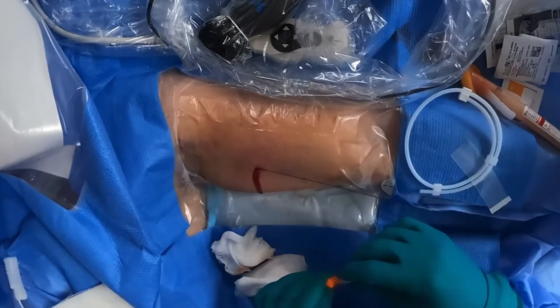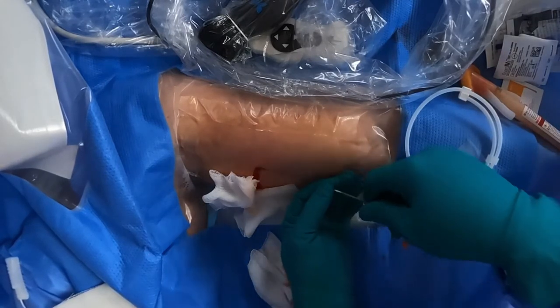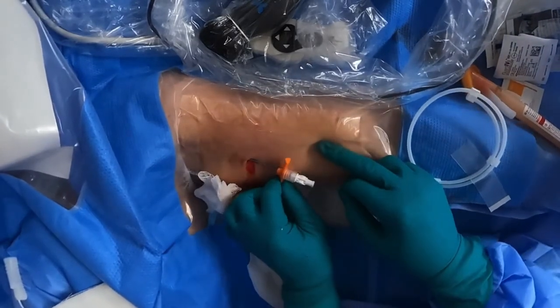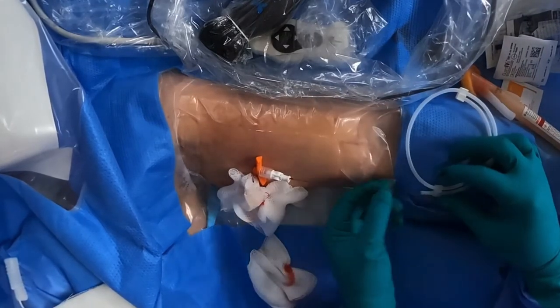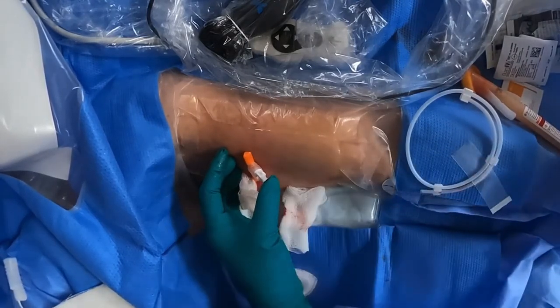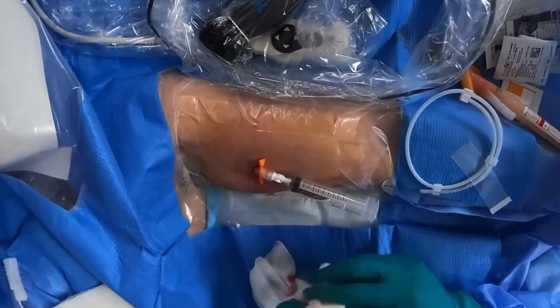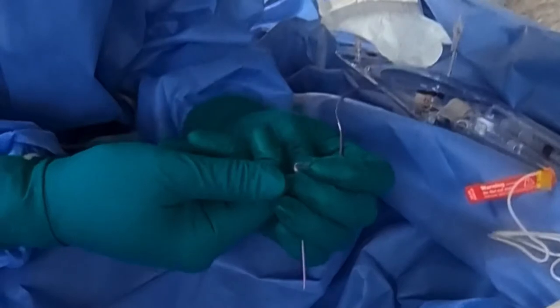I appreciate your patience by the way — I think we're at about the 10-minute mark. Now we're going to insert. Look how easy that goes in after the pre-dilation — no nicking. I haven't nicked in about a year and a half, and that was only because the patient had crab-shell skin. We're going to hold that while I get ready for the cut. I'm going to cut the catheter to length — we said 46 centimeters. Show the marker on my cut so people can more easily identify the length.